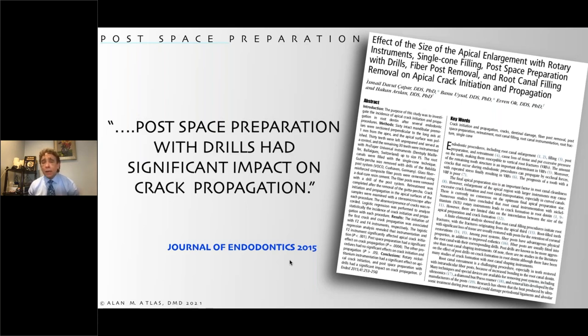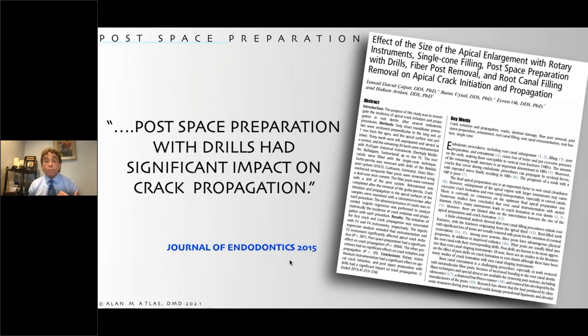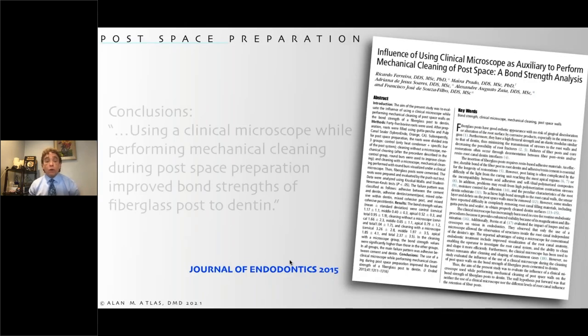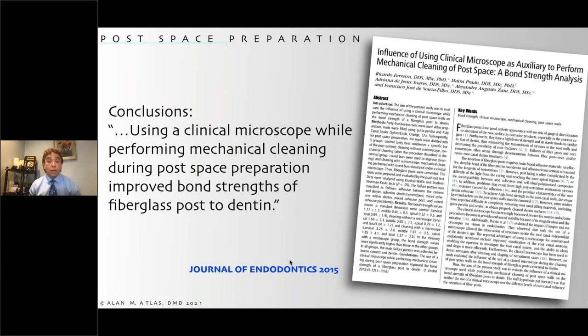And what about using the microscope in terms of creating a post space? Well, the microscope actually creates better cleaning of the canal, and because of that, we can get much improved bond strengths of the fiberglass post to the dentin. So again, we know the microscope is now a standard of care in endodontics. Whether you're a restorative dentist who does endodontics, or you're an endodontist who's going to make a post space, the microscope is absolutely necessary.